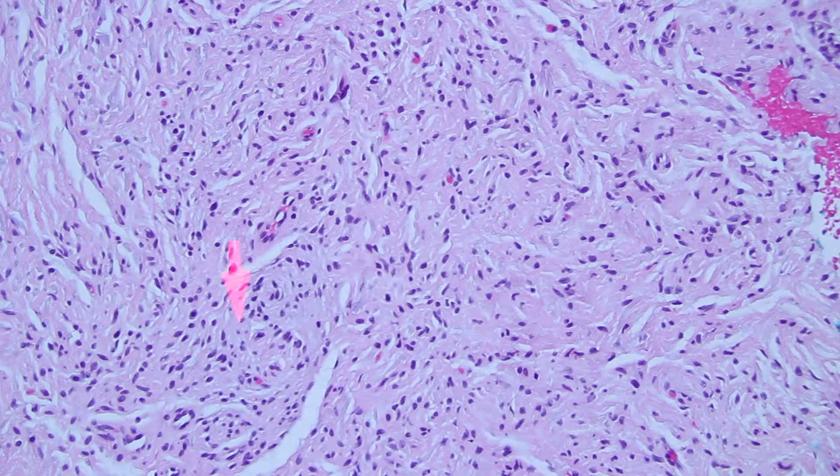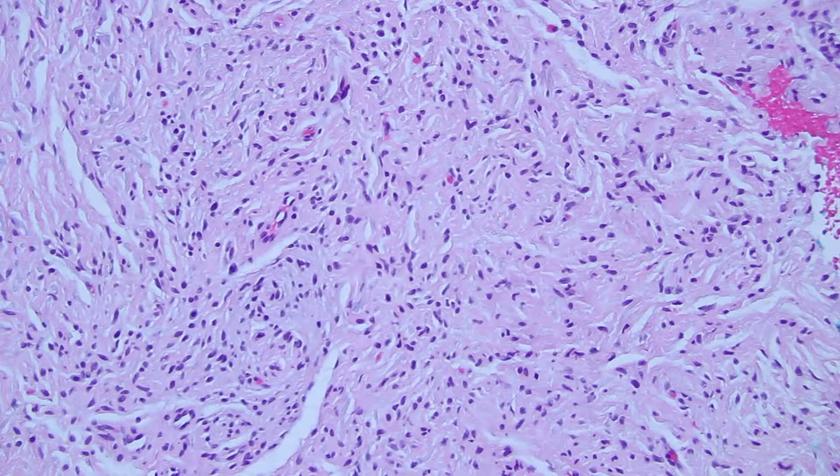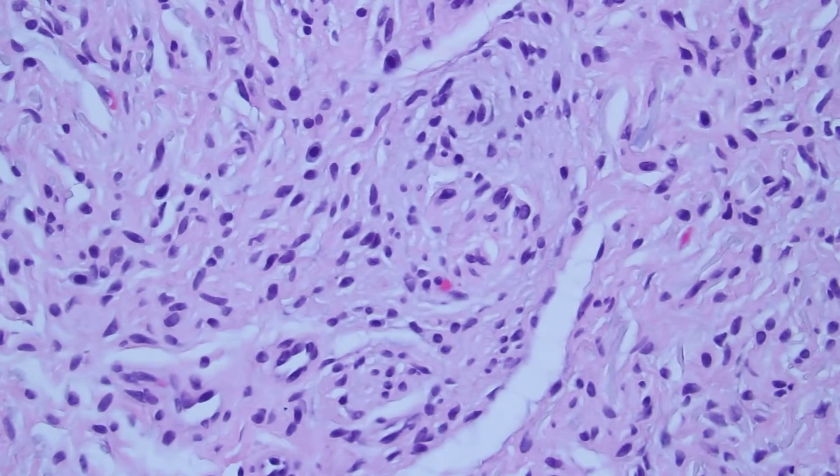They look a bit squirrely, unlike smooth muscle cells. Also, there are mast cells interspersed here and there.